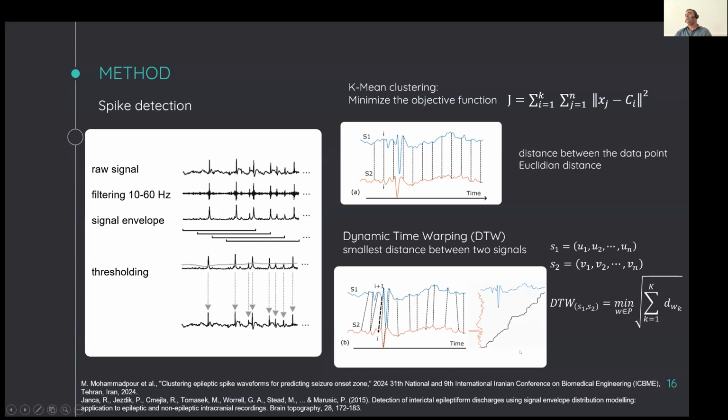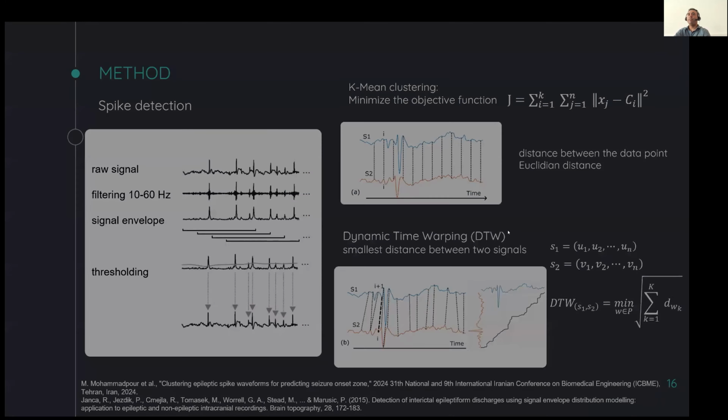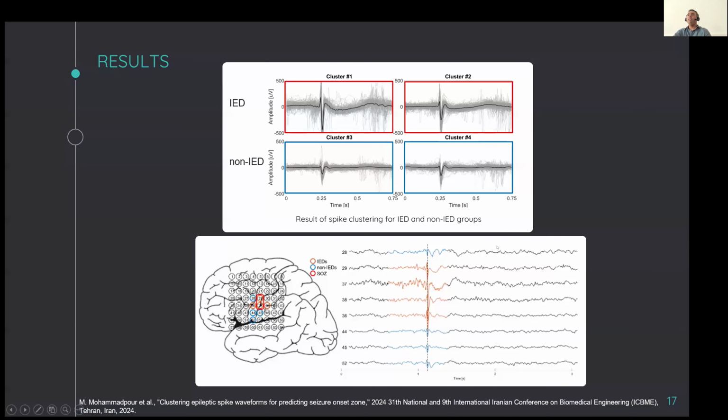Here we see these metrics, and it compares sample by sample, and at the end it finds the optimal path. When we then replace the core distance metric of the clustering algorithm with dynamic time warping, we find the best comparison. So here we see the clustering algorithm.